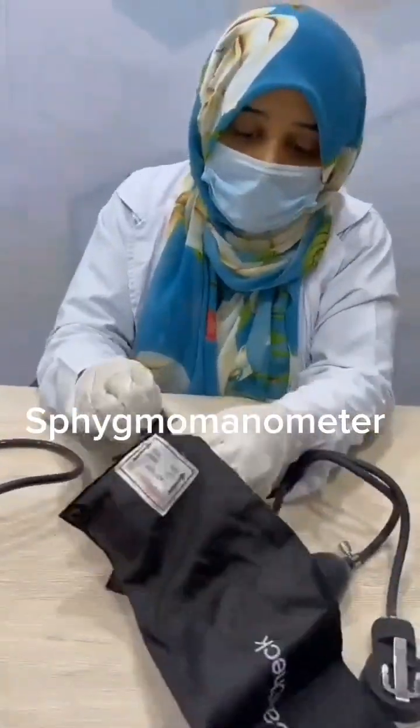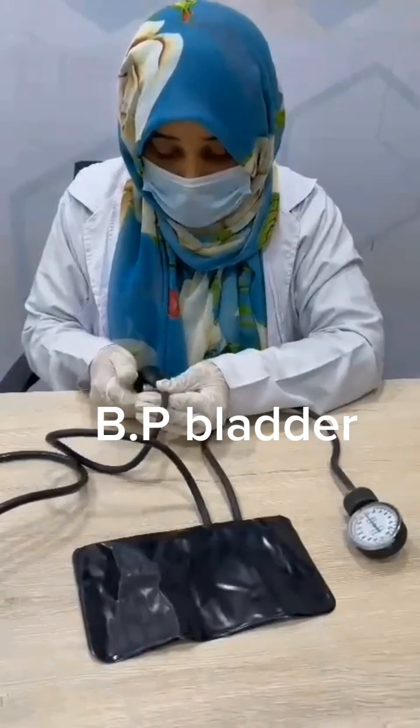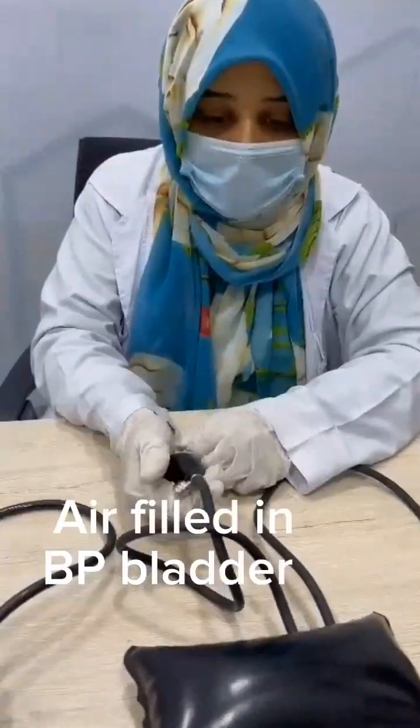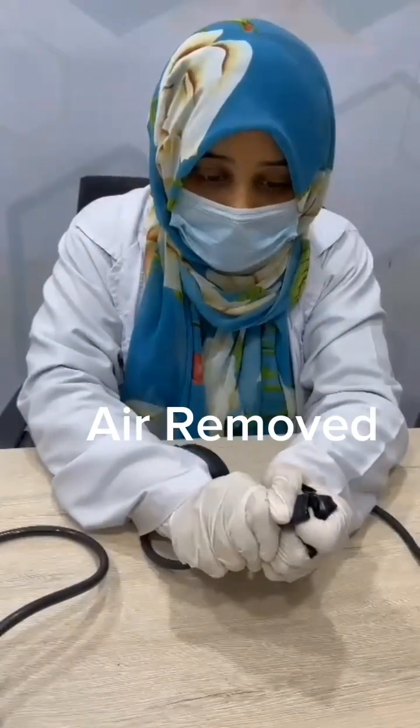This is the BP bladder. Air is filled in this bladder. Always remove air before the use. Close the air valve and fill the blood pressure bladder with air, and then remove the air.